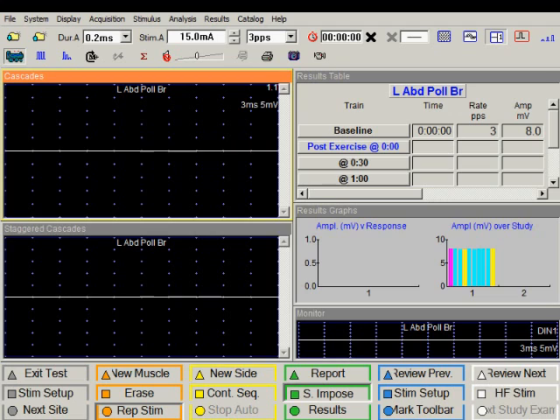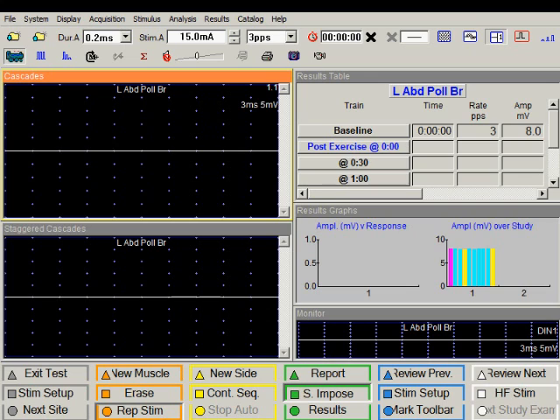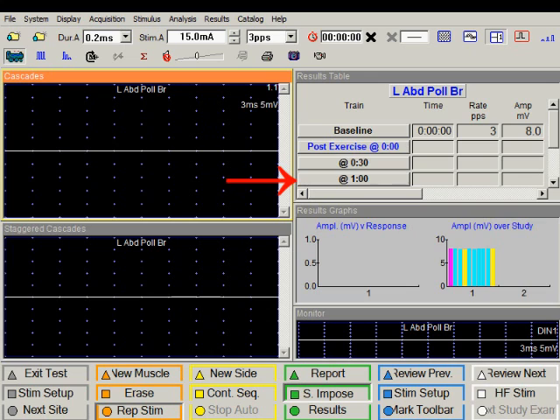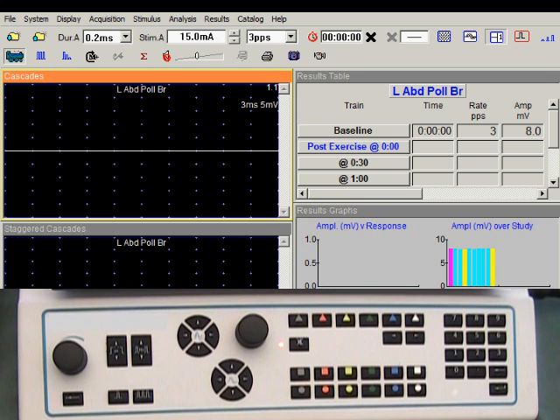Having performed the baseline study, we ask the patient to exercise the tested muscle and then deliver several trains of stimuli at predefined times. For example, immediately after exercise, 30 seconds after exercise, a minute after exercise, and so on. To deliver these stimuli in automatic manner, I'm going to initiate the continuous sequencing.